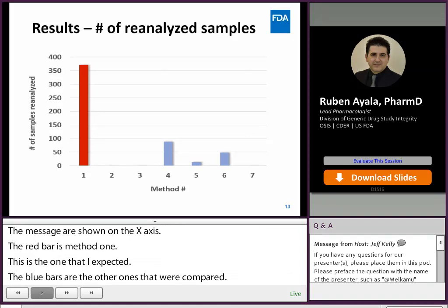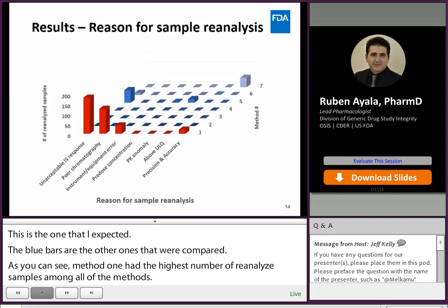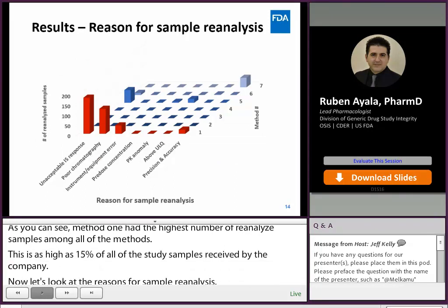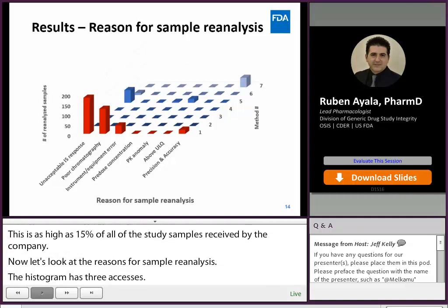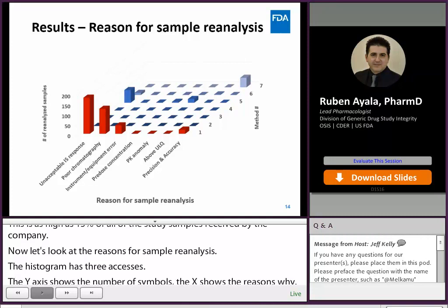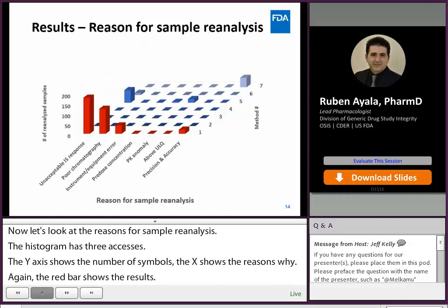Now let's look at the reasons for sample reanalysis. The histogram has three axes: the y-axis shows the number of reanalyzed samples, the x-axis shows the reasons for reanalysis, and the z-axis shows the methods being compared. Again, the red bars show results from method number one. Method one had more issues with unacceptable internal standard response variability, poor chromatography, and instrument errors than the other six methods. I will expand on these three issues shortly.